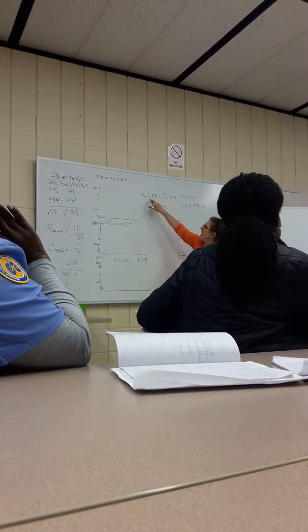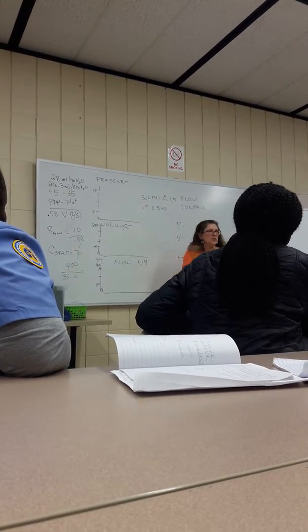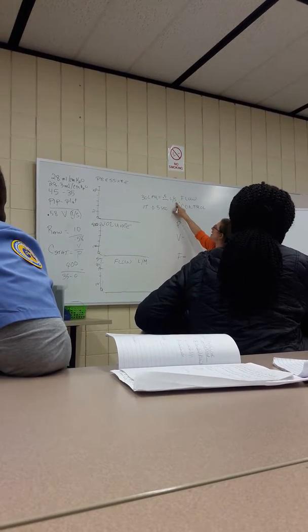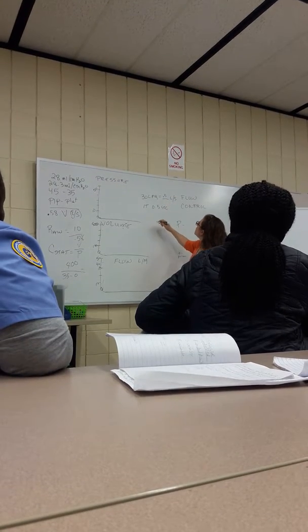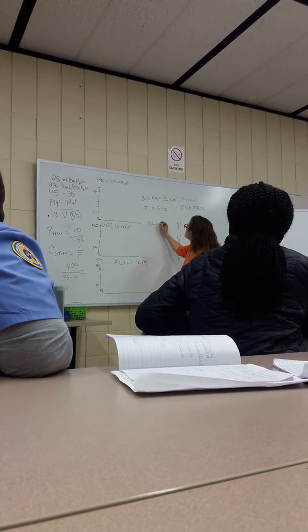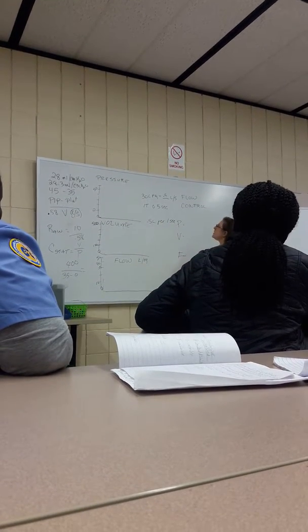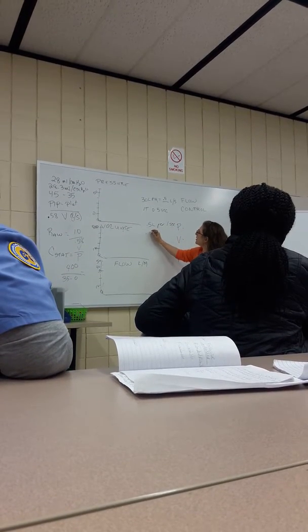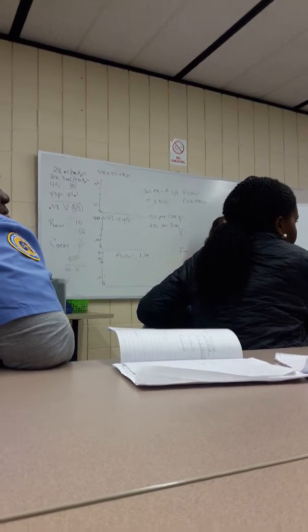Okay, I set my ventilator at 30 liters per minute. So 30 liters per minute of air is what's gonna come out of that ventilator. Let's make this easier and convert it to seconds. In 1 second, 0.5 liters is gonna come out, so in half a second, 0.25 liters comes out. This is a lot of math. We actually haven't gotten to the math yet.